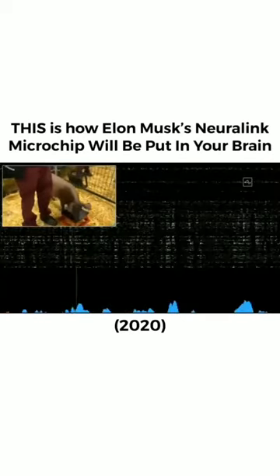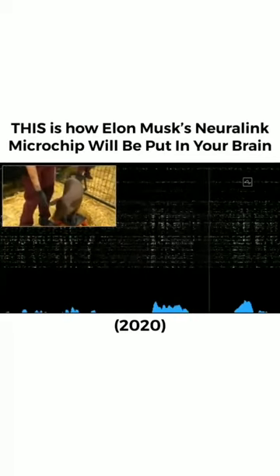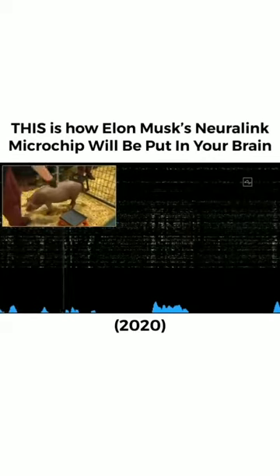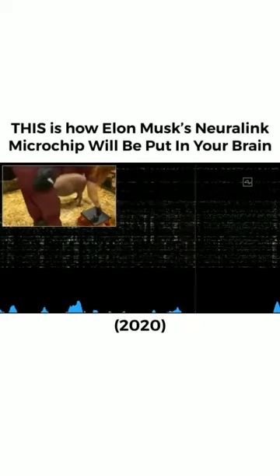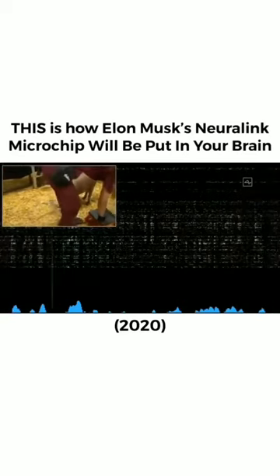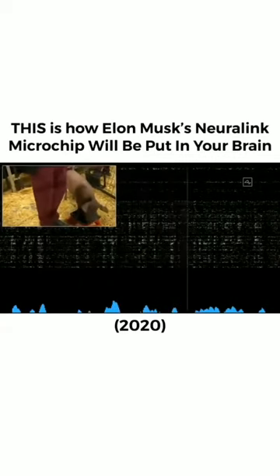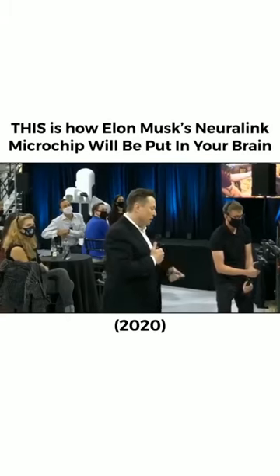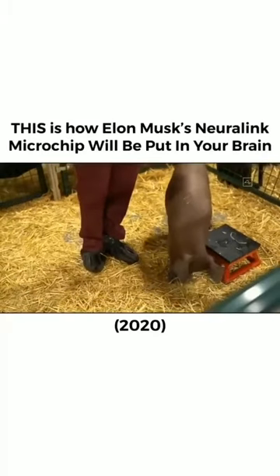And so on the screen, you can see each of the spikes from the 1,024 electrodes. If she snuffles around, touches this nut on the ground, or you feed her some food, pigs love food, then you can see the neurons will fire much more than when you're not touching this nut. And that's what's making the beeping sound. She's had the implant for 2 months. So this is a healthy and happy pig with an implant that is 2 months old and working well.